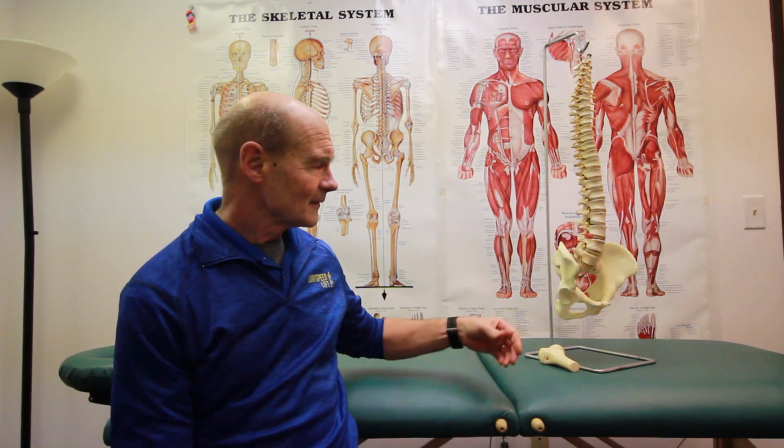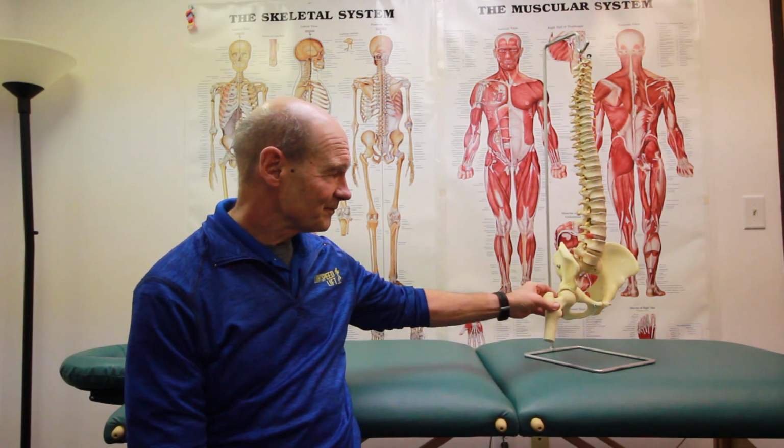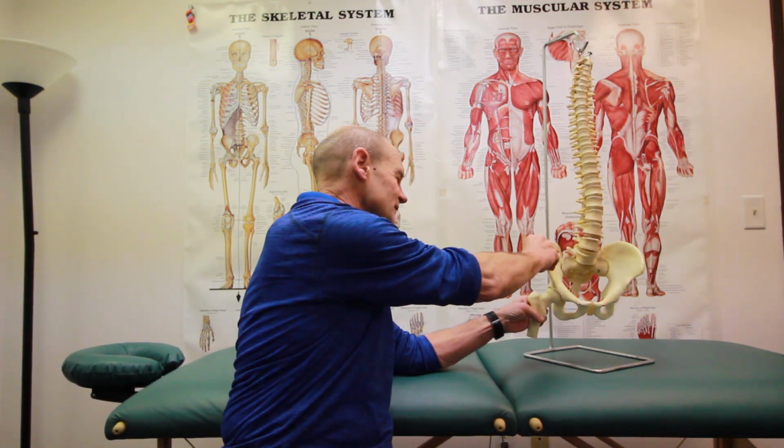What I didn't like though was the fact that the lift systems had to grab really hard around the diaphragm and rib cage. And many of them also included a little strap that went down through the groin region. So for me, the key to an effective body weight support system that was comfortable, easy to use, was going to be something that could provide that lift right through the hip joint.